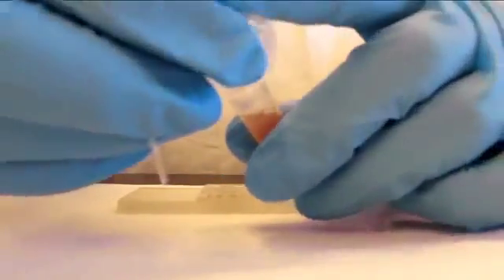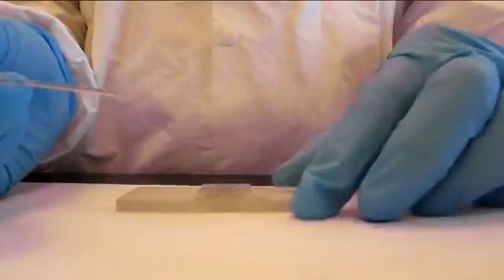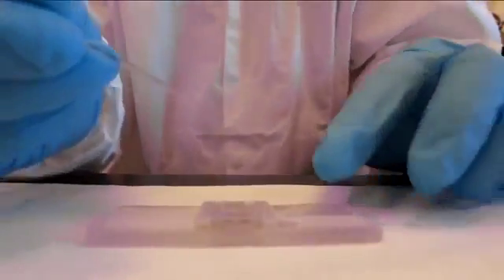Use an ordinary capillary tube to place a few drops on the slide. The cover glass should be on top at this point. Make sure not to overfill the slide or else you will have to clean it and start over.